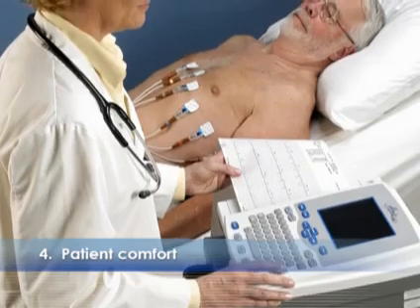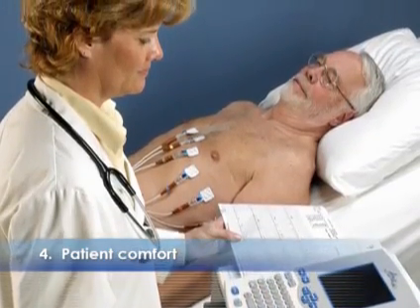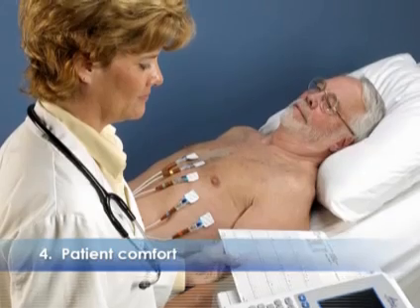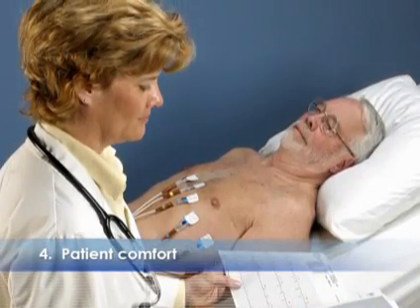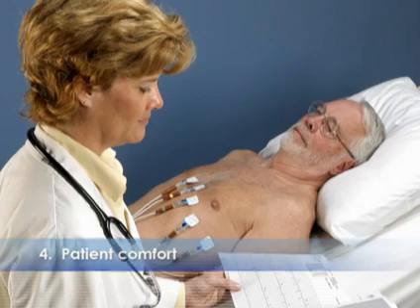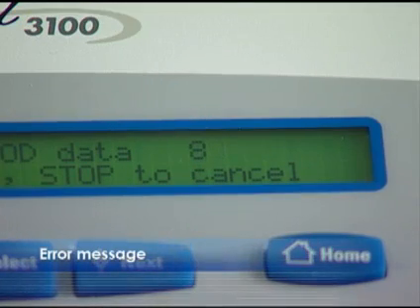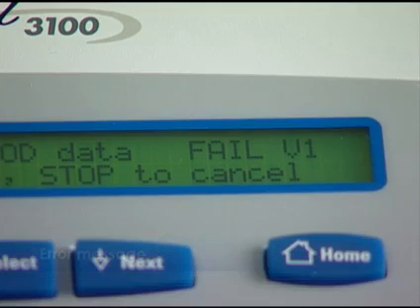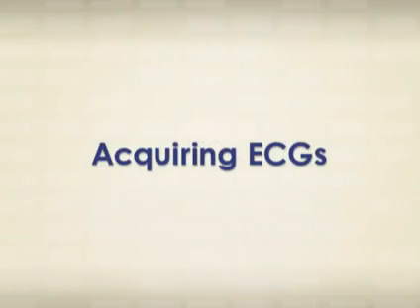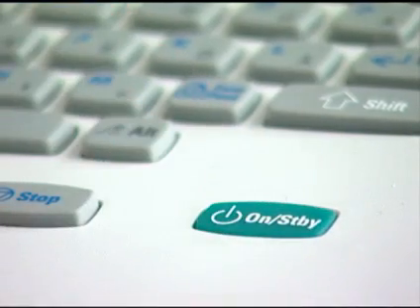To minimize muscle artifact, make sure the patient is warm, comfortable, and relaxed. Be sure the patient is on a surface appropriate for his or her size, and there's no stress on the arms or legs. If the leads aren't connected properly, an error message will say Fail and identify which lead failed. Now it's time to acquire the ECG. After the patient is prepped, turn on the Atria 3100.